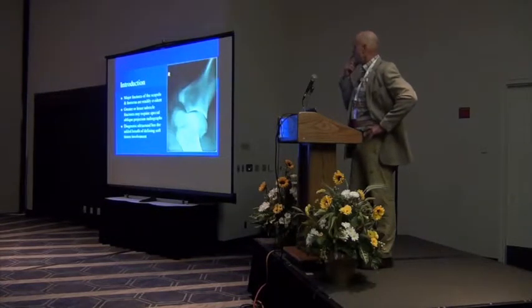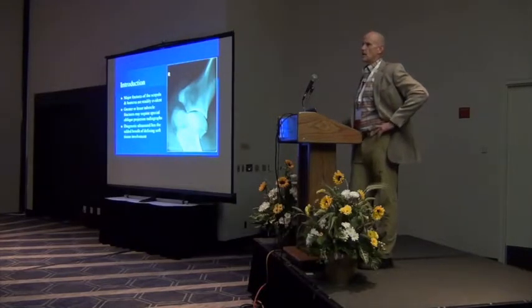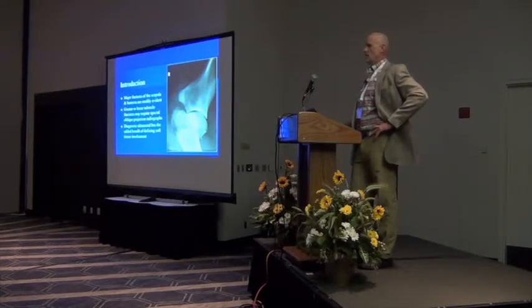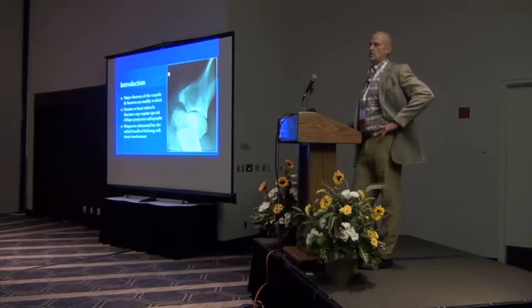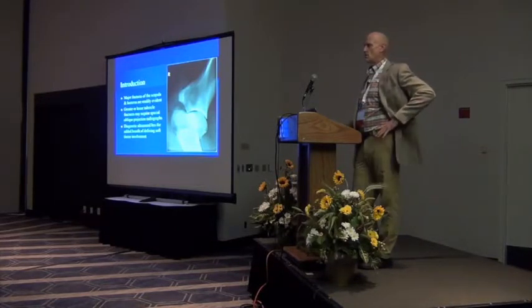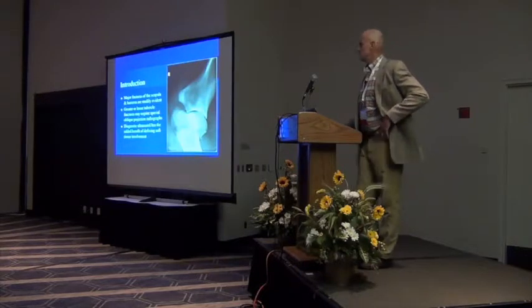And as we go through, hopefully it'll emphasize that not often do we see hyperextension type injuries manifest in this joint. Most of what I was picking up when I was doing the retrospective, pulling out cases, is trauma. Generally, the majority of things that we see are traumatic in nature. In our practice, we do a lot of eventers, hunter jumpers, and dressage horses, and they've usually either run into a fence or fallen doing something, or as always, they got in fights out in the field with other horses. So then the problem becomes just exactly what's involved and how do we go about managing these things.